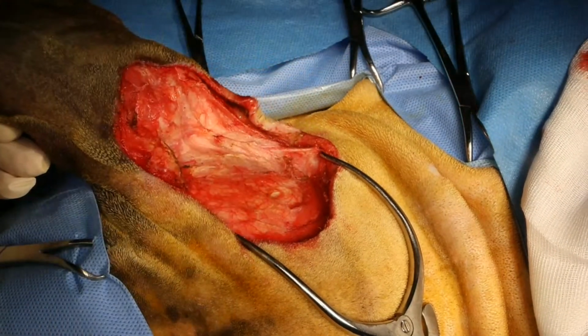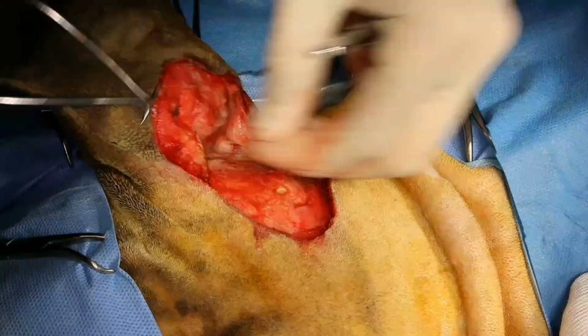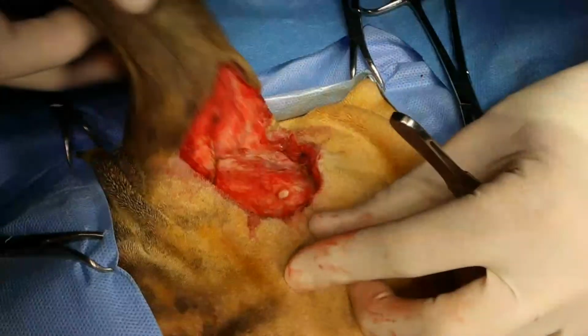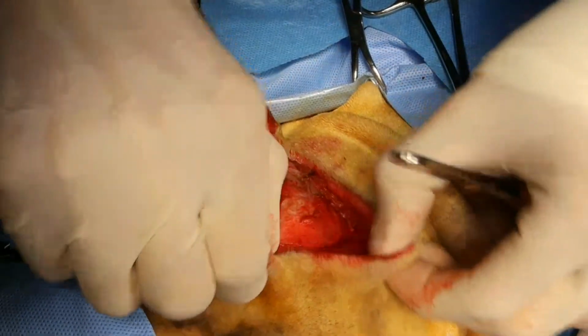The referring vet is one of our former interns, and he was a good surgeon. So he would be able to do that without having to come back to us. All right, so that's going to close primarily, I reckon.